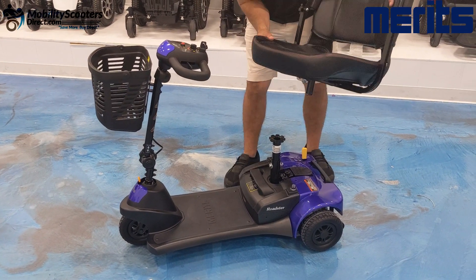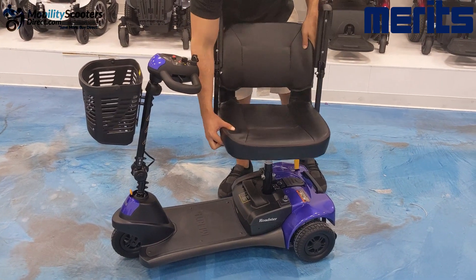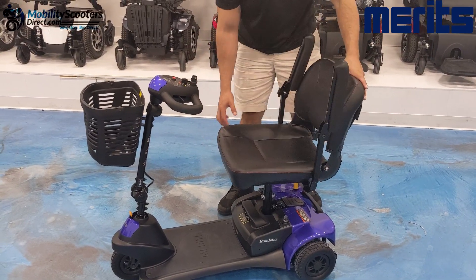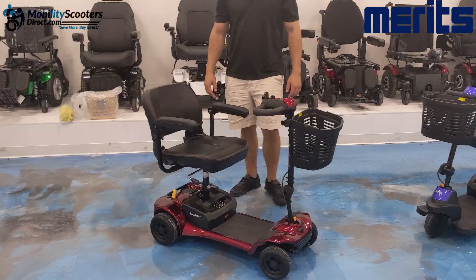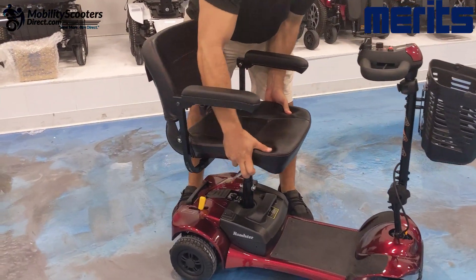The seat has a male connector on the bottom which slides into the seat post. You do need to engage the rotation lever when putting the seat in — if you do not have that rotation lever up, the seat will not lock in and you won't be able to use the rotating feature.